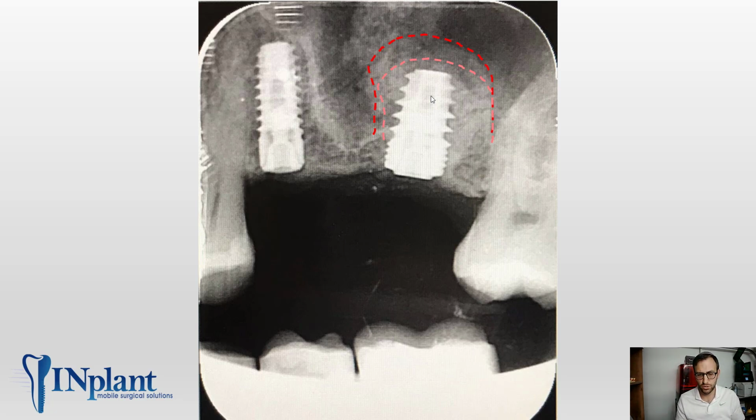What the implant is doing is two things. One, it's giving us obviously the physical implant, but secondarily, it's keeping the rest of that membrane up, and that'll allow that clot to form around it, and it stabilizes that clot even further, and will allow the bone to heal around it. So this is going to work out extremely well. And again, it's just a matter of having the experience there. I was there live with a doctor and able to talk him through this and say, don't abort, this will still work out well.